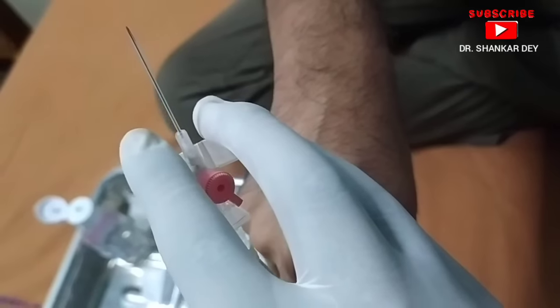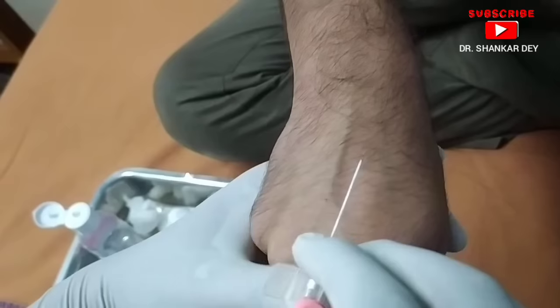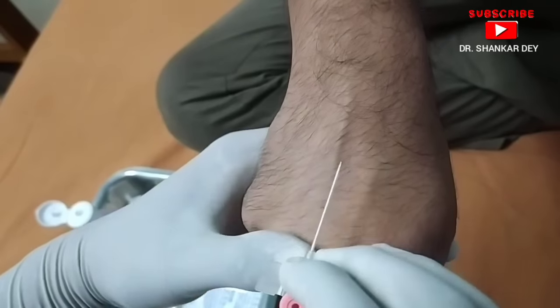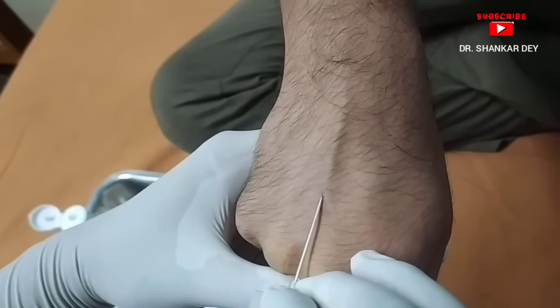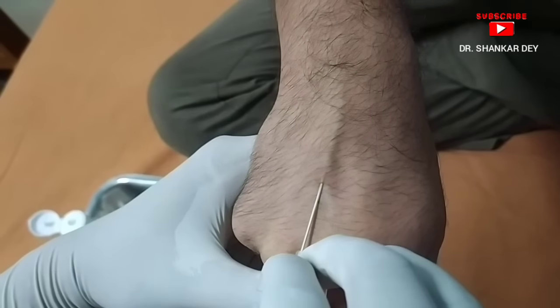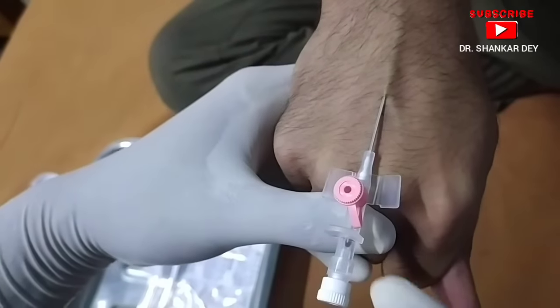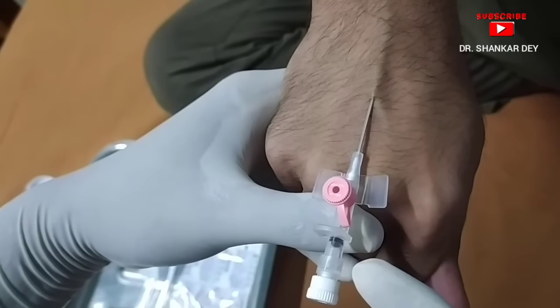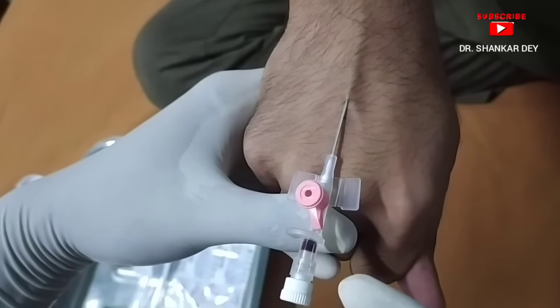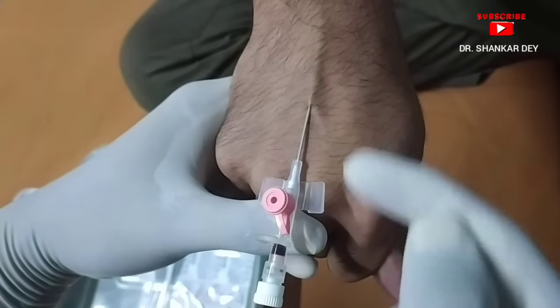The vein to be punctured is steadied, and the skin is punctured with the cannula keeping it at about 15 degrees to the skin. The needle with the cannula is advanced through the subcutaneous tissue into the vein. As the cannula enters the vein, blood will be seen flushed into the distal end of the cannula — as you can see, blood has flushed into the distal end.